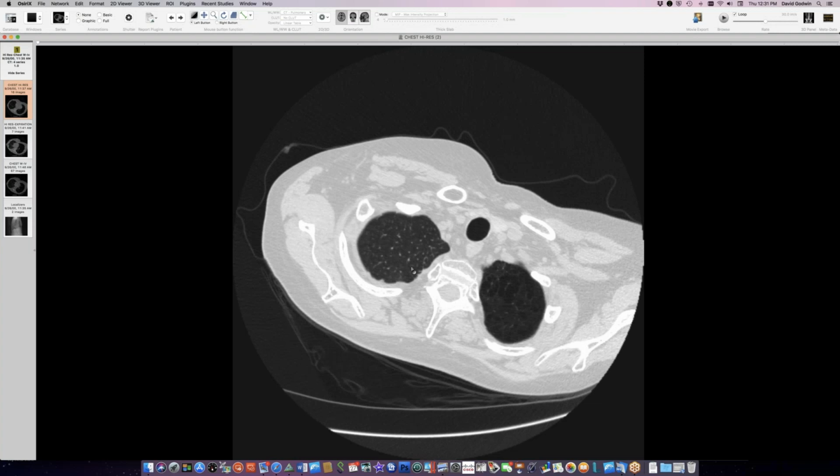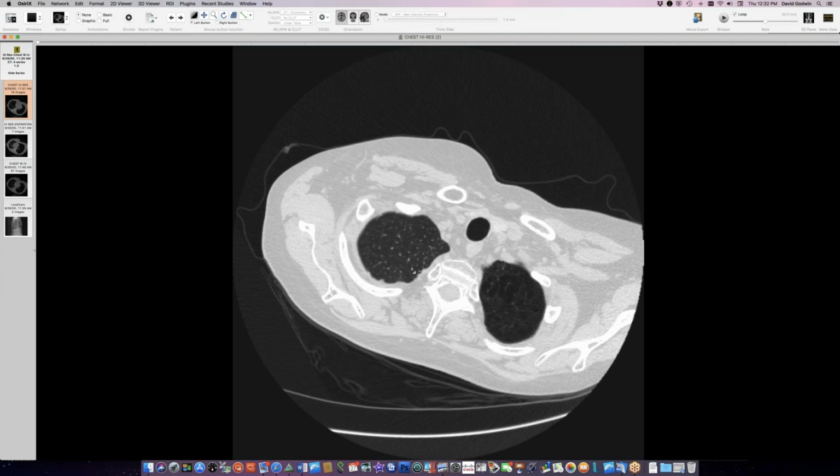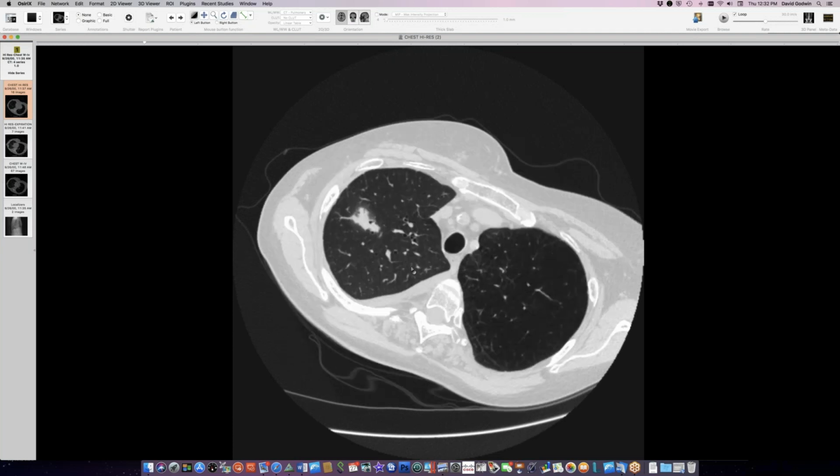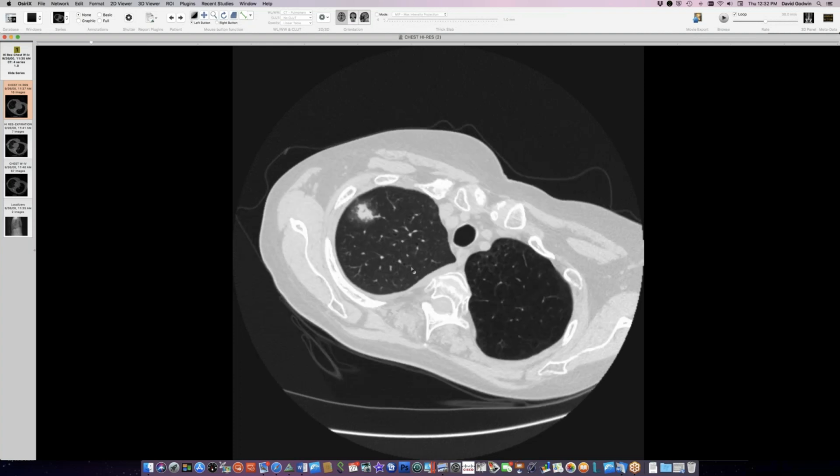We did a study back in the 2000s trying to determine when somebody with a solid organ transplant, might be heart or liver or kidney or something like that, or lung, came up with a nodule. Could we tell radiographically what was the cause of the nodule? So I was pretty confident going into that study, but not very confident coming out, because it turned out it was fairly random what I thought, and I thought with great confidence. So I think I would have gone with fungal infection for this, but this turns out to be PTLD. So very nice halo sign, should be aspergillus. Doesn't always follow my rules.